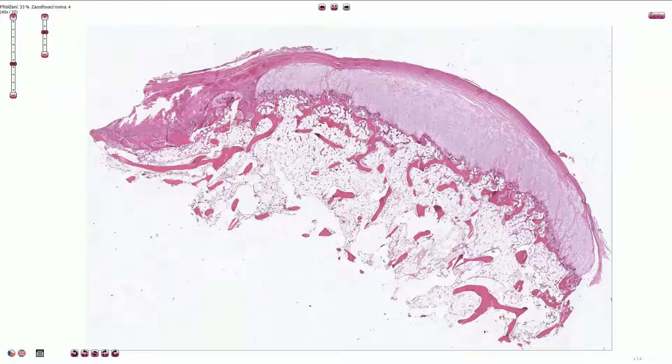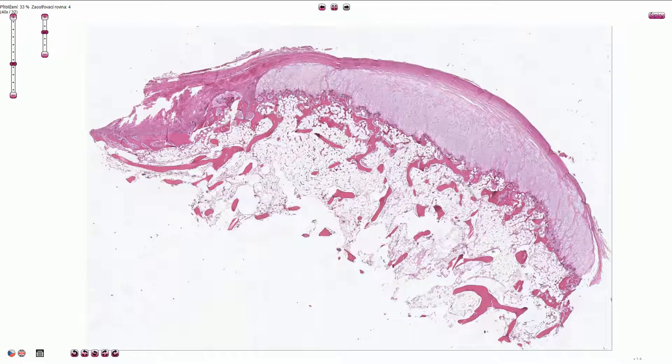Here we are looking at the osteochondroma. It is a benign tumor which arises on the surface of the bone, usually near the metaphysis.